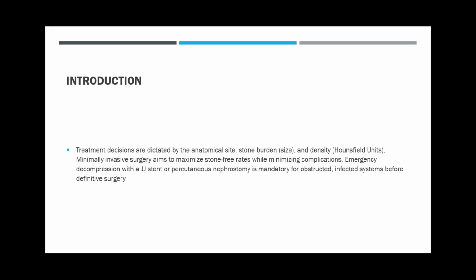So treatment of urolithiasis is directed by the anatomical site, size and density of the stone. Minimally invasive surgery aims to maximize the stone-free rate and to decrease complications.